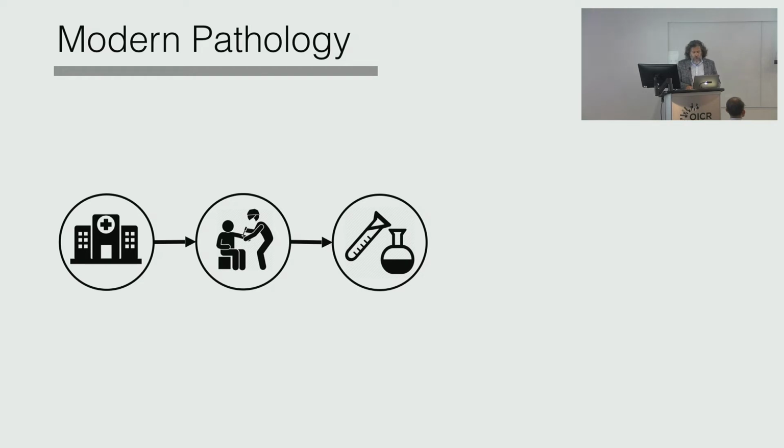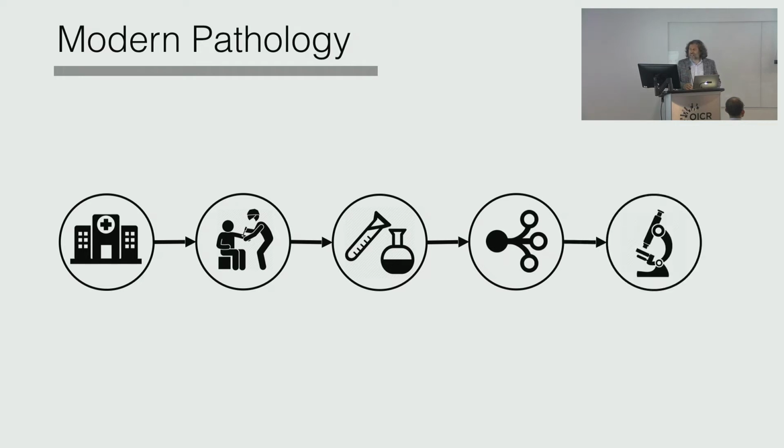After it gets processed, it goes to some sort of distribution channel, and that distribution brings the tissue sample to the pathologist, and the pathologist is the last instance. What we do in radiology is basically an educated guess. Nobody gets treated based on what is suspicious in an X-ray. What the pathologist says goes. That's the end of the line. That's the definitive diagnosis, and that's the reason that pathology is so important.